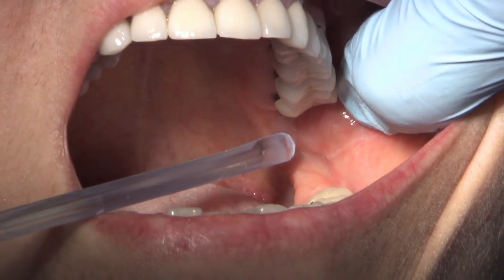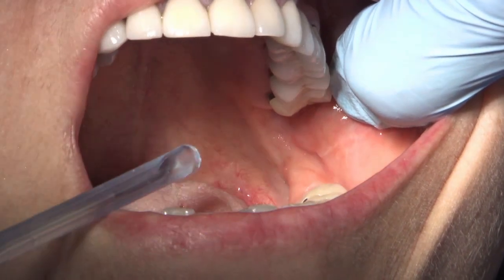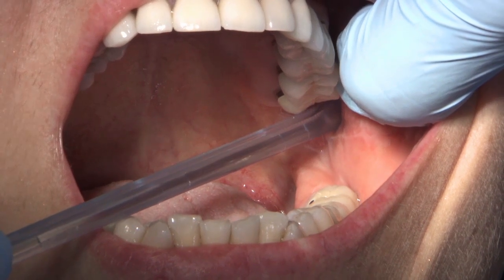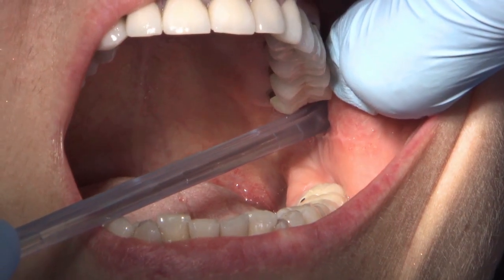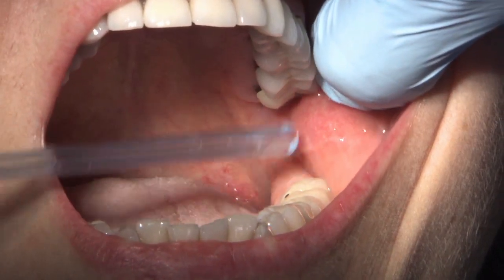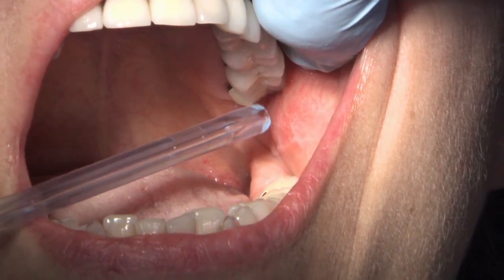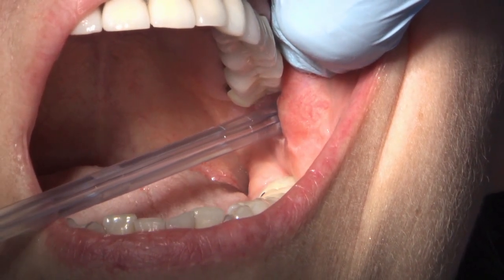I'm going to be distal to the second molar, but still coming in over the bicuspids. Penetration will be there — open as wide as you can for me. Slightly uphill inclination, and again as if I'm able to track towards my finger that's palpating on her condyle. Any idea why you'd use the mesiolingual of the first molar versus the second molar since you're back behind the second molar? It has to do with the height of the condyle — if I'm using a tooth up higher I'll be higher, and that gives me a line with the height of the condyle.